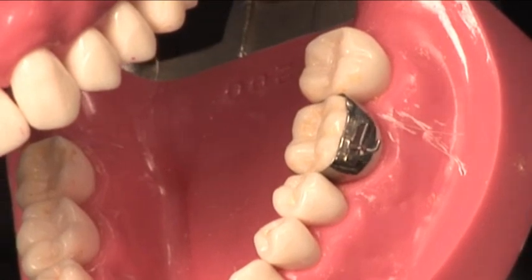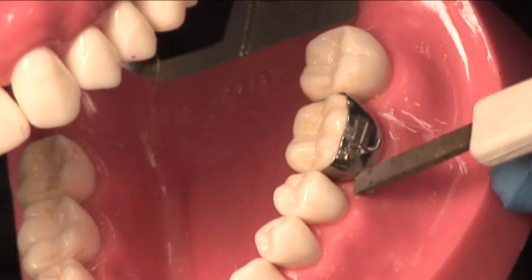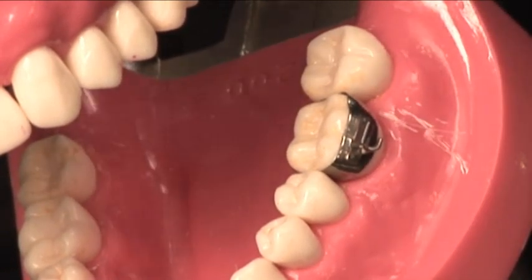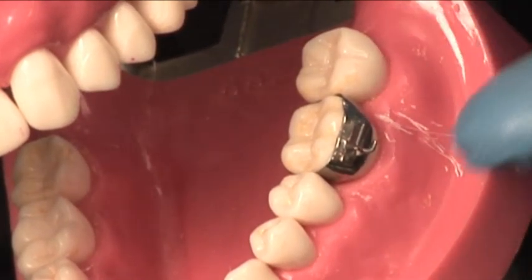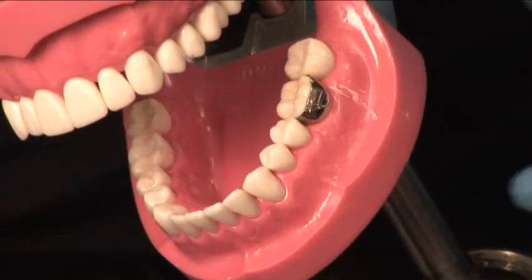Usually you don't have to worry about the base of the tooth, but it's always good to make sure that your contacts interproximal are pretty tightly fit.